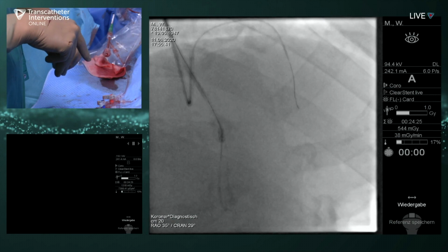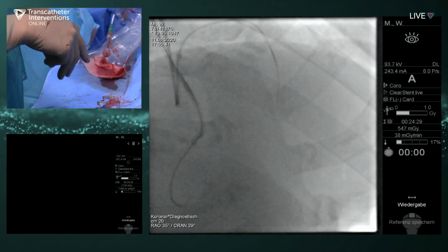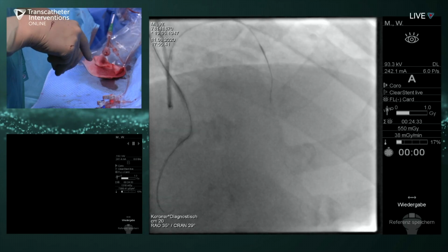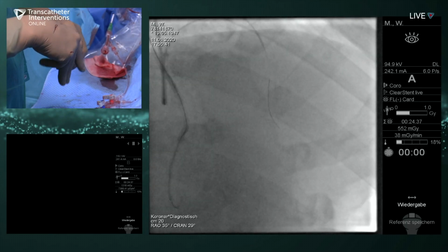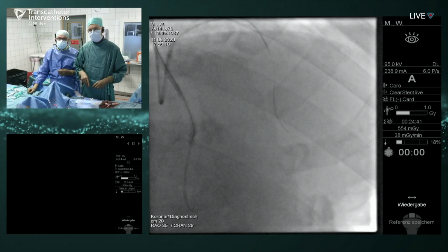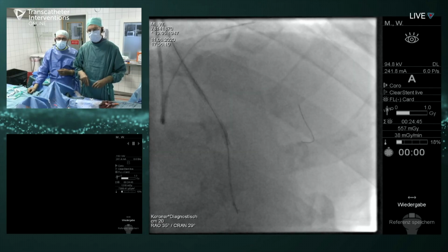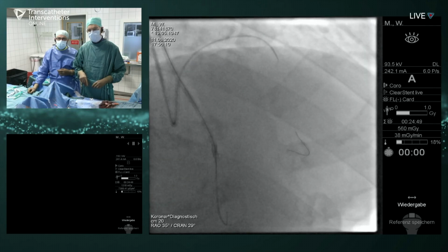And if it didn't, I'd come back into the bigger one. But there is quite a lot of tortuosity in that larger branch, and a lot of it is just about feel. There's also a really apical looking septal further down the LAD that could be explored later too. But sometimes this is just trial and error.